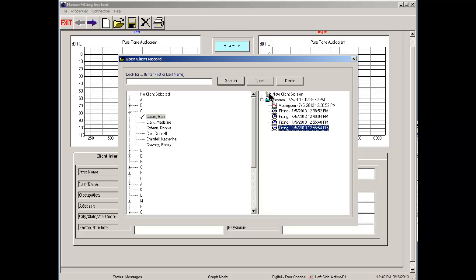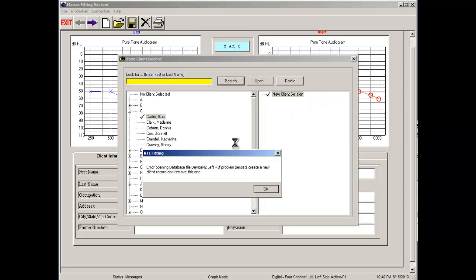I'm going to click on one. I'm going to click open. And this is where we find this glitch that's persistent. That's always going to pop up whenever I try to load in that old information. As you can see, it says RTI fitting, error opening, database file device NZ left.